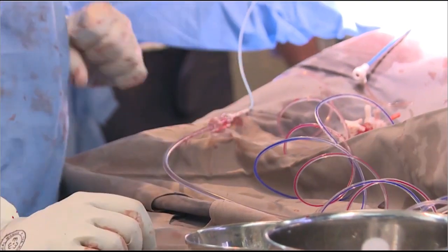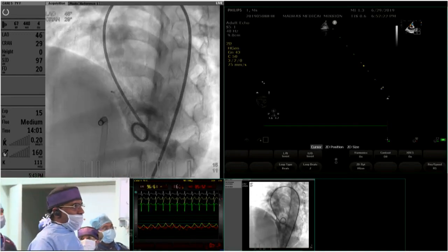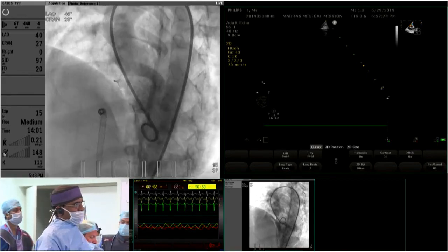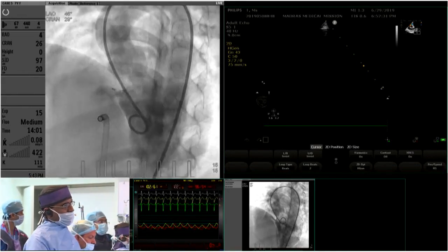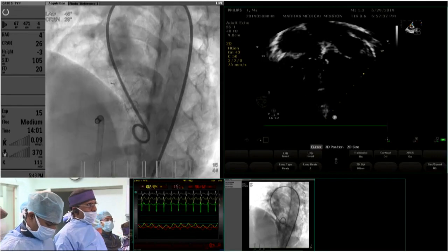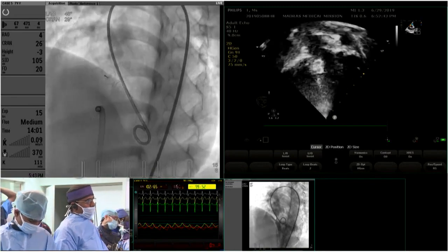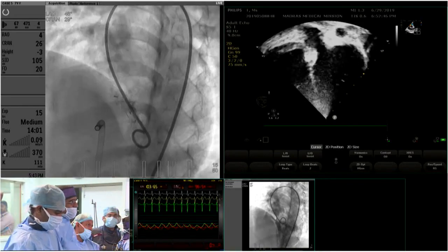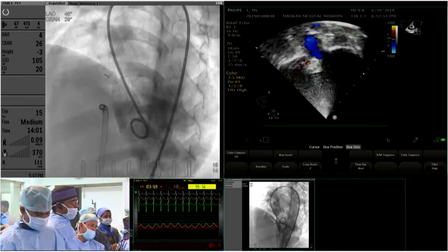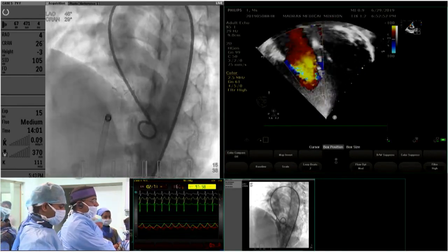So this was an Occlutech perimembranous 6 mm device. We are in the central waist part, we are not actually oversizing. The reason, so the chances of a radial stress stretch on the margins of the VSD causing an injury to conduction is possibly less likely. Since the device has got a peculiar shape where the RV disc actually keeps moving away from the right ventricular wall, there is no clamp on this device. So it's hoped that the chances of AV nodal conduction disturbances are possibly a little less, even though some sort of proper studies have to be done.